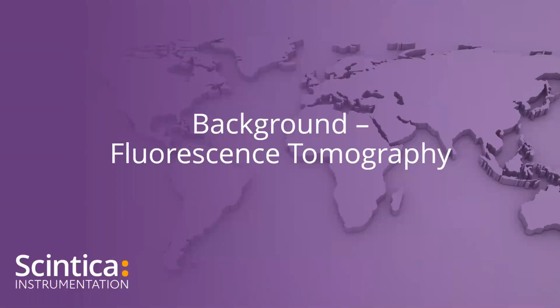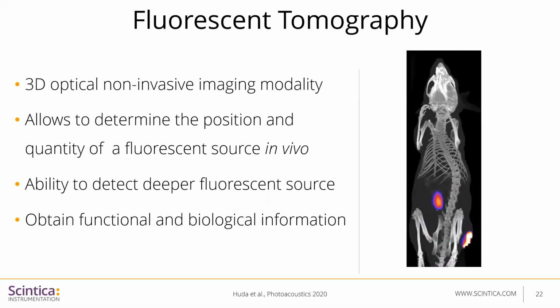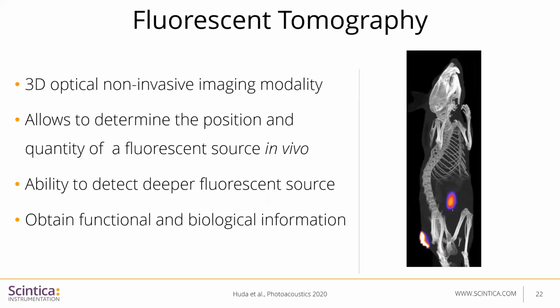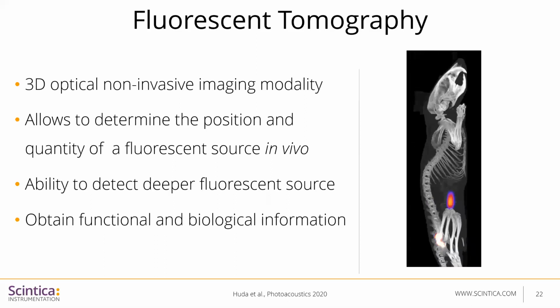So now, as we're aware of the basics of photoacoustic tomography, which in short is light in and sound out, we will next look at fluorescence tomography. Fluorescence tomography is a three-dimensional, optical, non-invasive imaging modality.